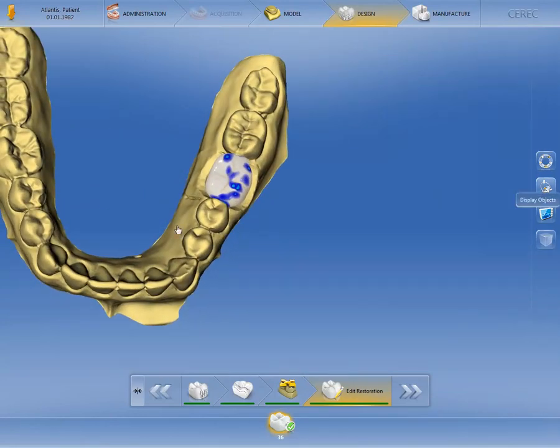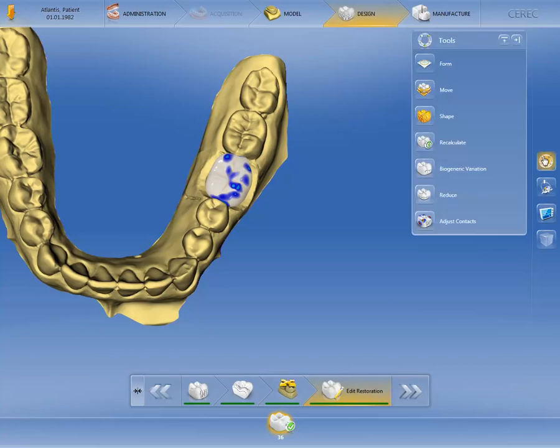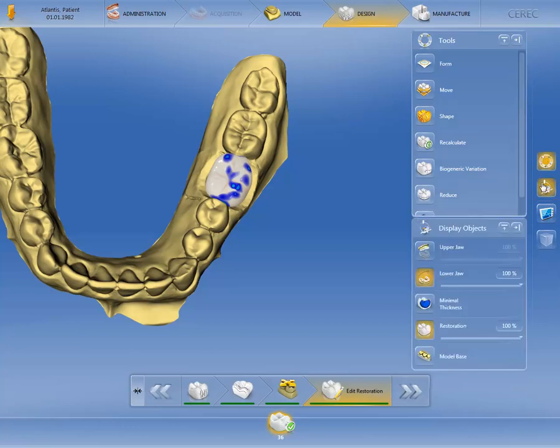The restoration can be modified using the familiar tools and options available in the side panel. With the help of these tools, you can rework the morphology of the restoration, and also show or hide the respective jaws by activating the display objects option. In our case, we will make no further adjustments and move on to the last phase, Manufacture, by clicking the double arrow.